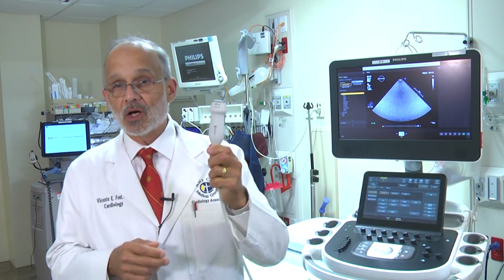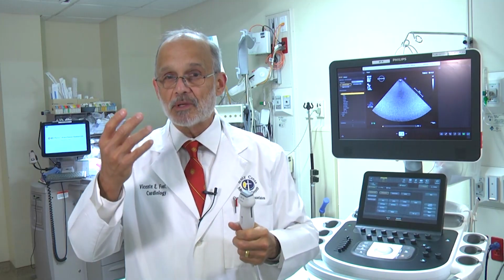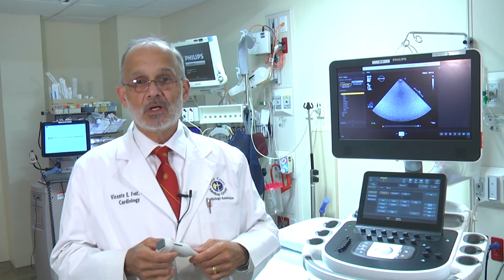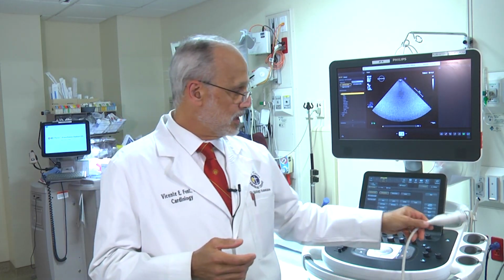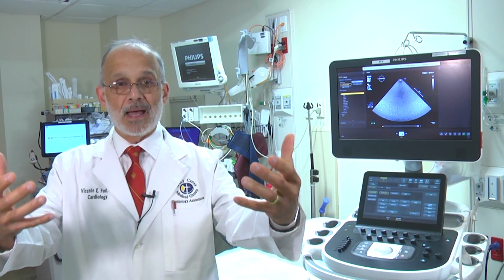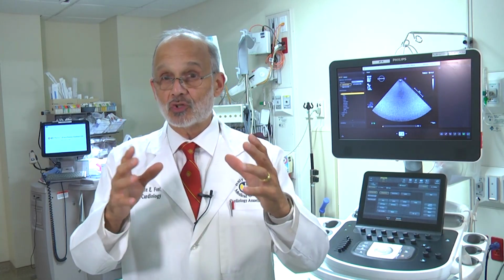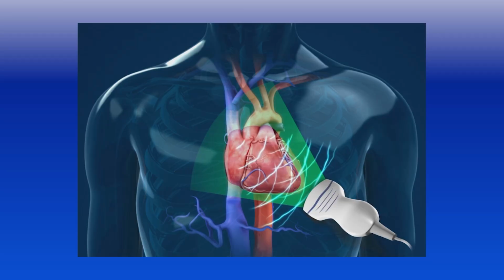By reading these echoes with its supersensitive ears, the bat can then determine the location, the distance, the size, the texture, the speed, and even the shape of the object in question. Because these are registered, they bounce back to the bat's ears, and the bat can determine all those things that it's trying to find out, similar to what we do with echocardiography.